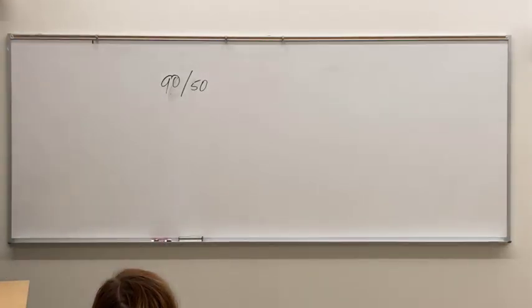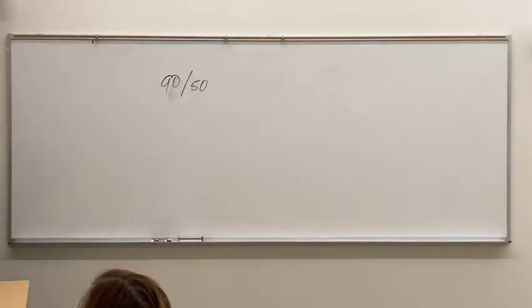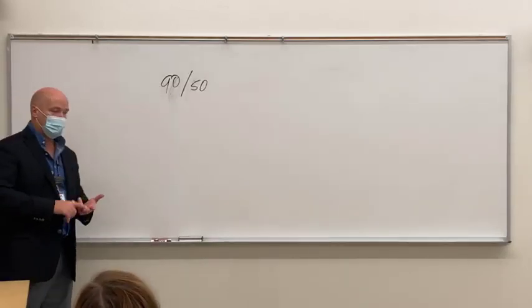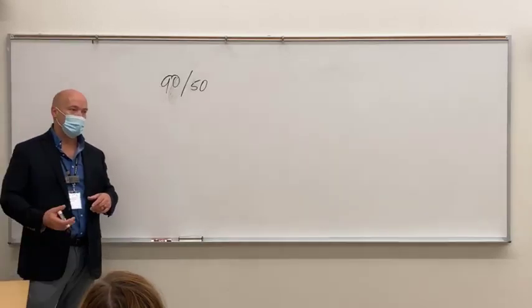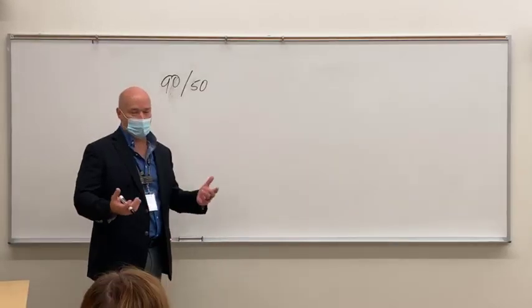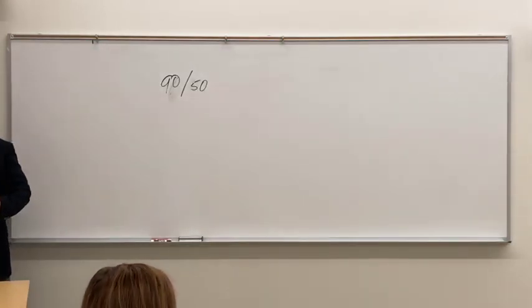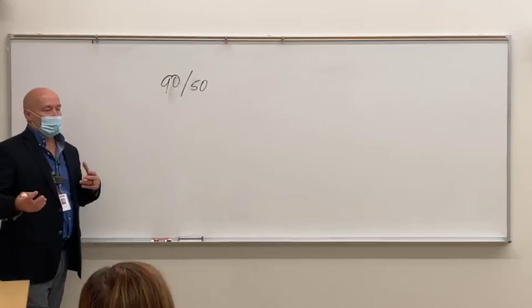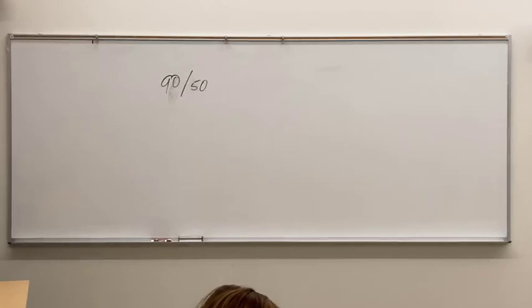So we talked about the operating console and what all we control at the operating console is the quality and the quantity of the x-ray beam. We control a lot of stuff there. We can control KVP, MA, time. We can control what kind of timers we use, whether they be a phototimer or usually an electronic timer. More on timers again in a minute. But we could select focal spot size. We could select a lot of different things, right? Which bucky we were shooting into and all that. So that was one portion of the imaging system.